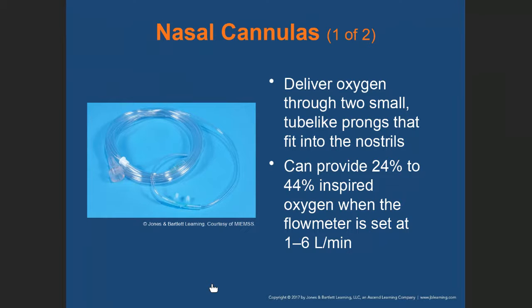In the field, you will not exceed 3 to 4 liters. So if you have to go above 3 or 4 liters with a nasal cannula, you might as well give your patient high flow oxygen. So do not exceed 3 to 4 liters.